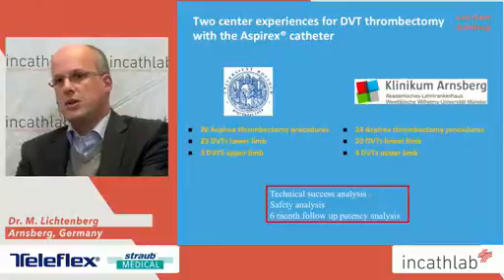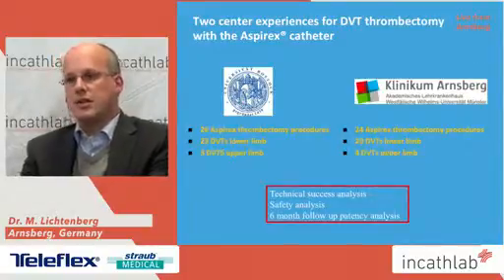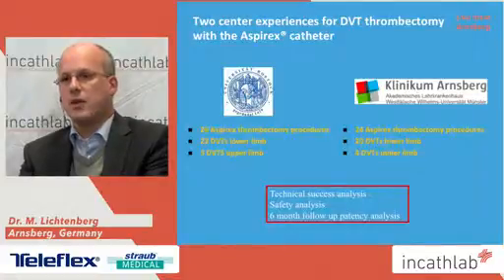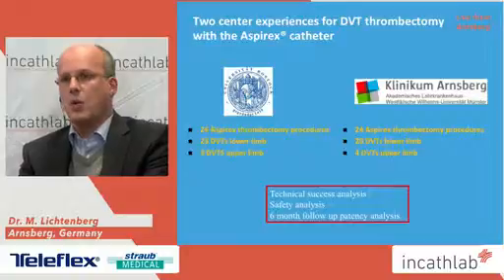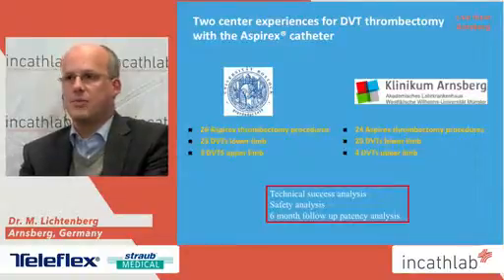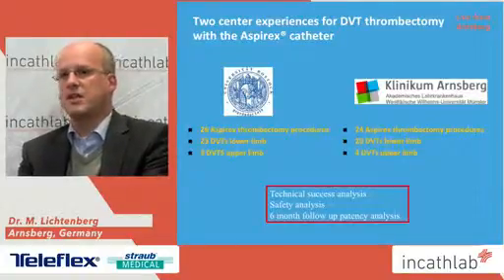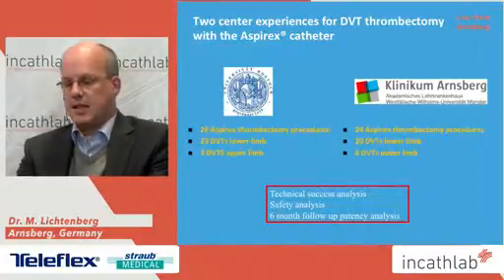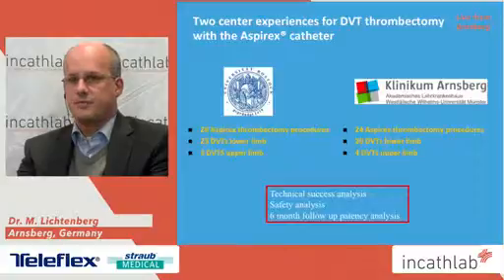I want to show you a two-center experience registry for DVT thrombectomy, which we performed together with the University Clinic of Rostock, where we analyzed the performance of this catheter in different indications, mainly in patients with descending and ascending iliofemoral thrombosis.